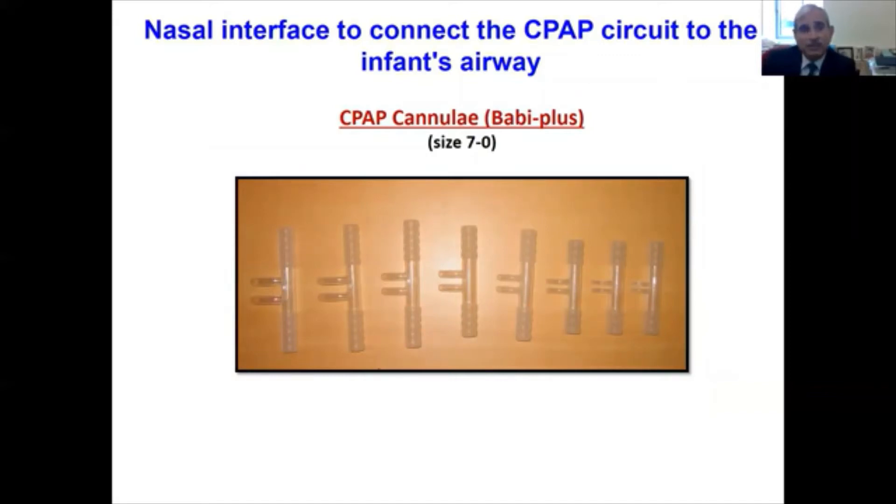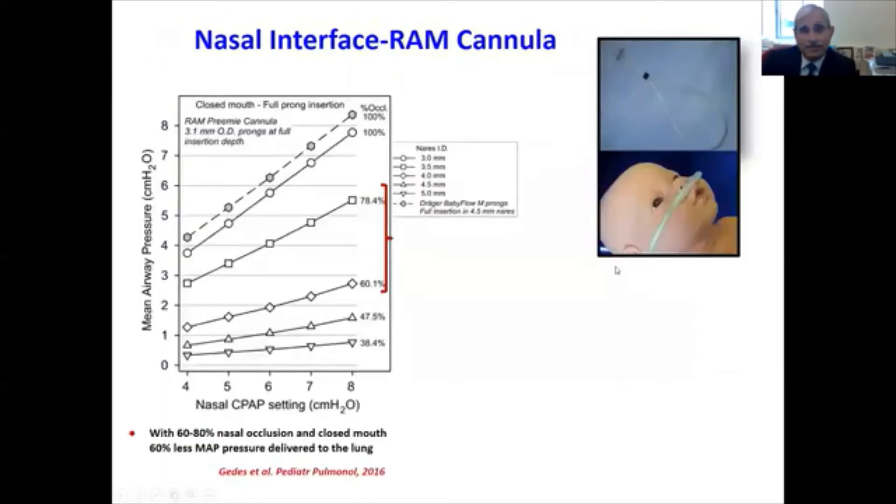The advantage of the Baby Plus brand is that they are made of silicone, so they are not PVC and are latex free. We use the two extreme sizes — size seven and size zero — for very tiny babies at Columbia University.